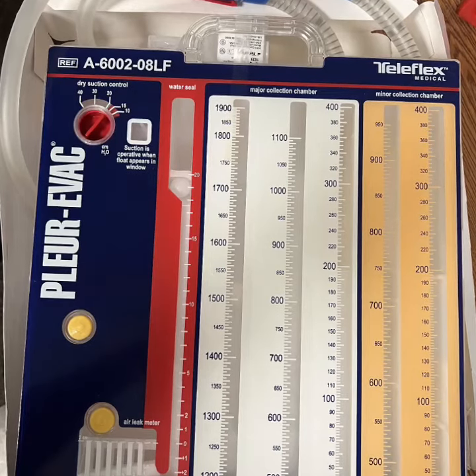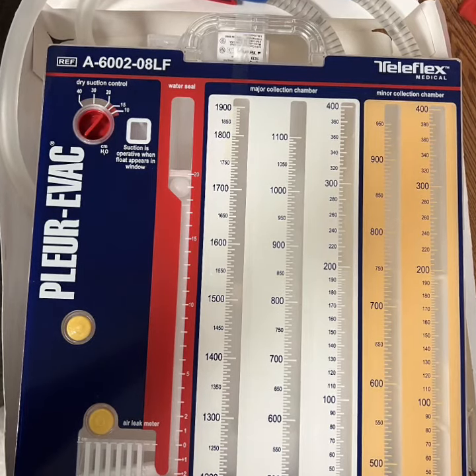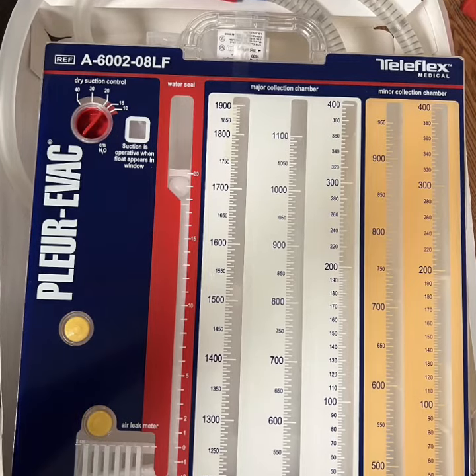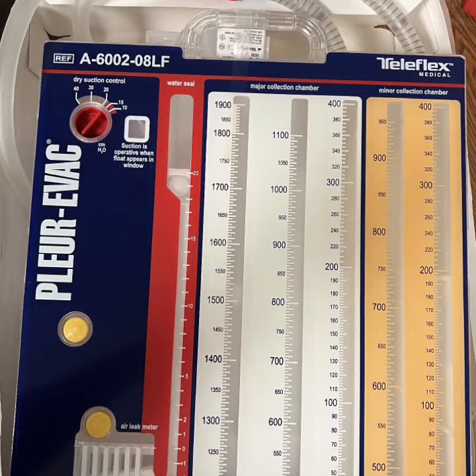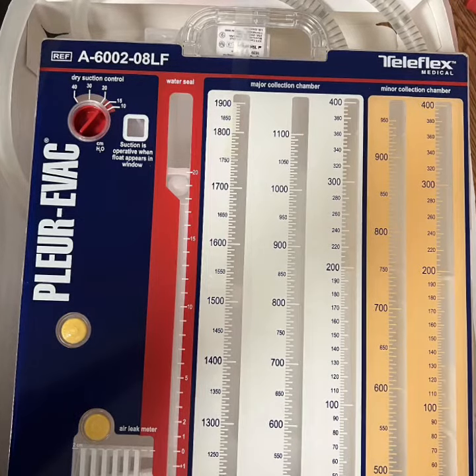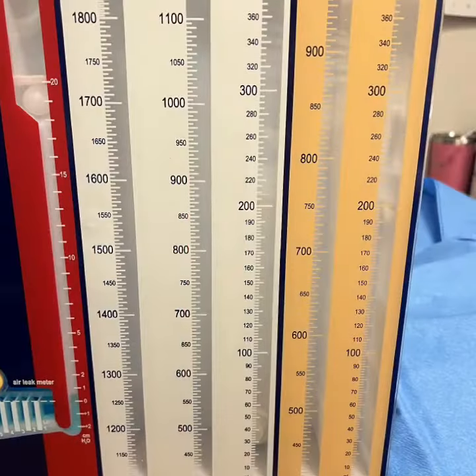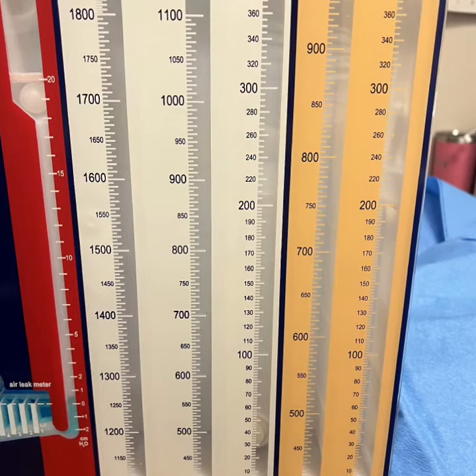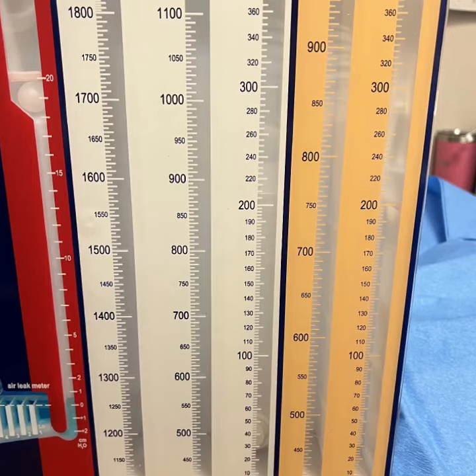We now have new Plurivac collection containers. They are for one or two chest tubes on the same side of a patient. They have two separate collection chambers. The two collection chambers, yellow and white, are completely separate from each other.